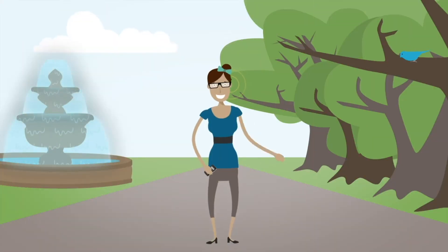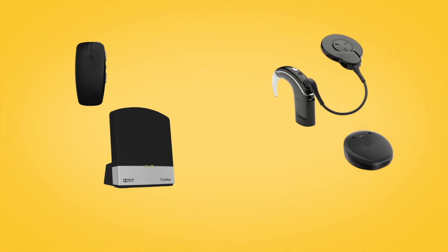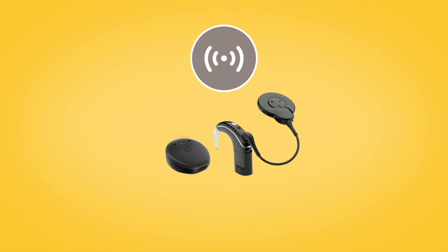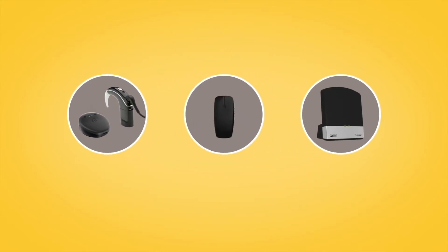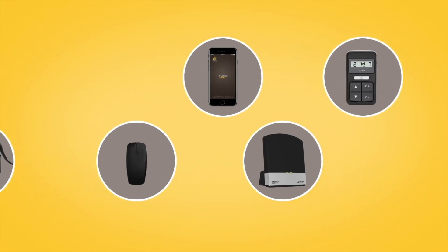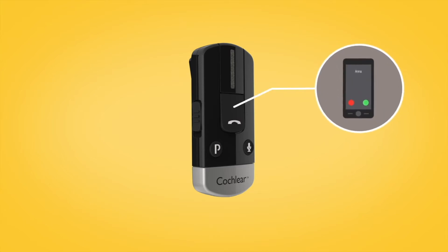With the Cochlear True Wireless range, you can wirelessly stream sound to your Cochlear Nucleus 7 or Kanso 2 sound processor. Once paired, a mini microphone or TV streamer can be controlled from the Nucleus Smart App or the CR310 remote control. Streaming from a phone clip is done automatically — just use the controls on the phone clip to make and receive calls.